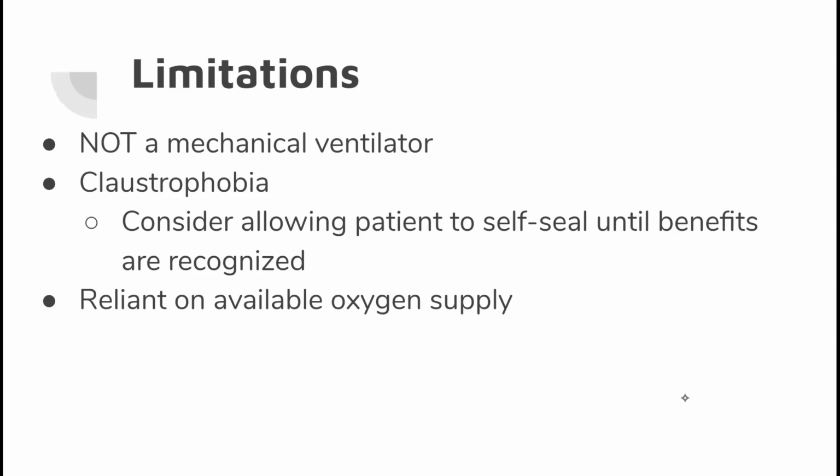It is also not a mechanical ventilator, right? It's just pushing air in. The patient still needs to participate, which is part of the reason why it's better than intubation. They still need to activate their respiratory muscles, whereas in intubation, you're taking over all of that. You also need to make sure that you have adequate oxygen, right?